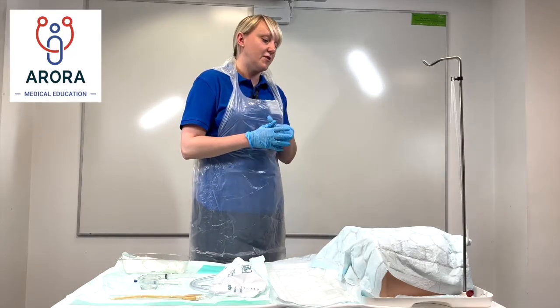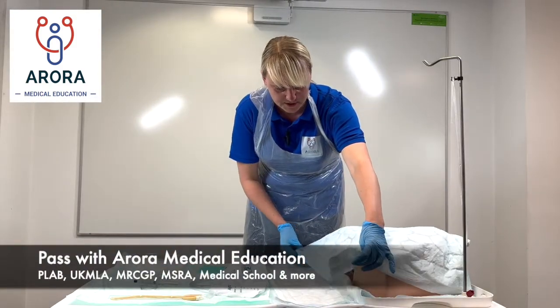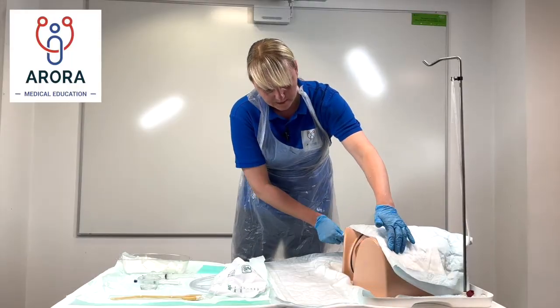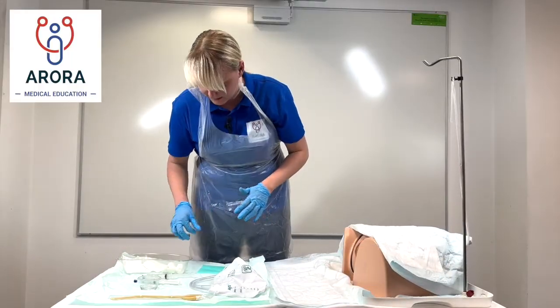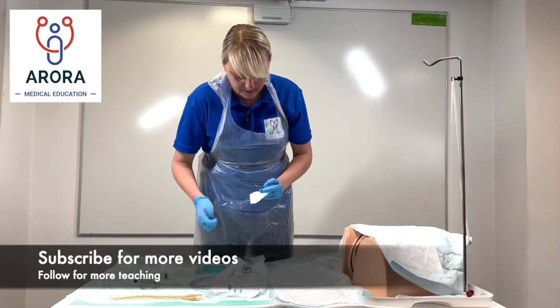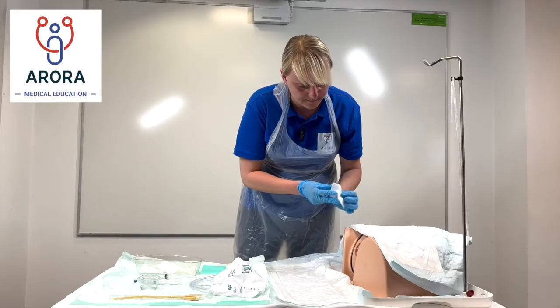'I've got a chaperone with me who will be here at all times. I'm just going to remove the sheet to expose the area, checking that it looks clean. What I'm going to do first is clean the area with some cotton wool — it might be a little bit cold but let me know if you have any pain at all.'